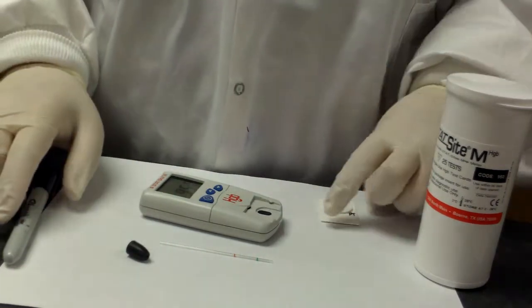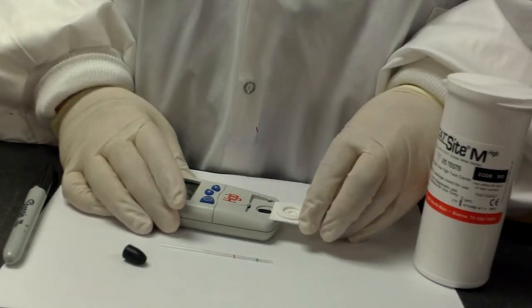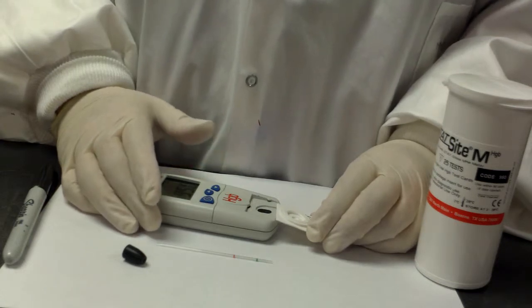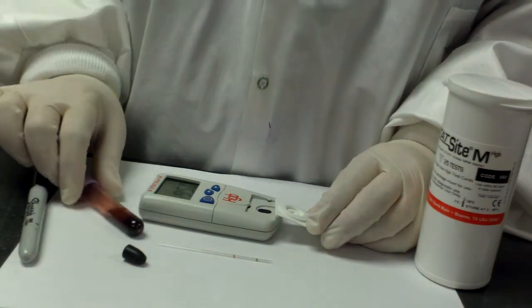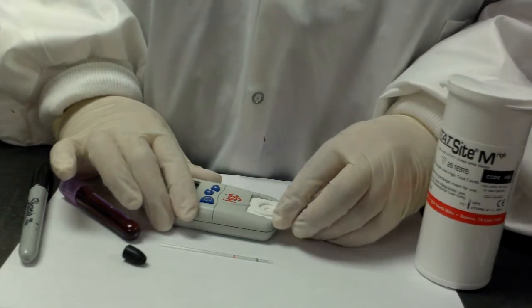We can do this either from a finger stick or from a tube of blood. If we're doing it from a finger stick, we're going to identify our patient before we begin. If we're doing it from a tube of blood, we need to use a properly labeled, properly collected EDTA specimen, just like all hematology specimens. You're going to slide this in.